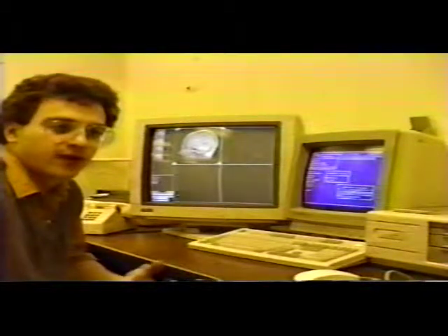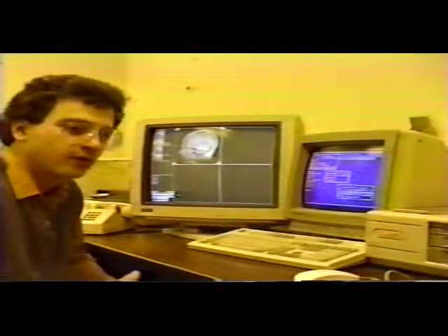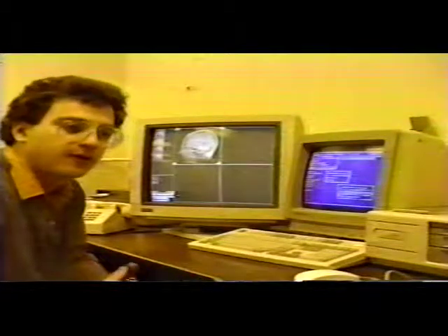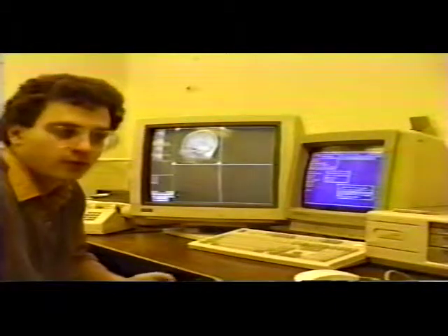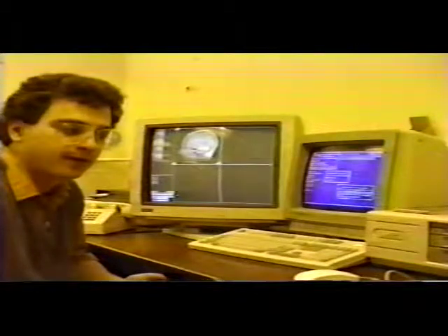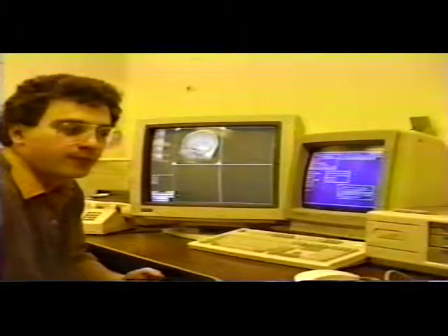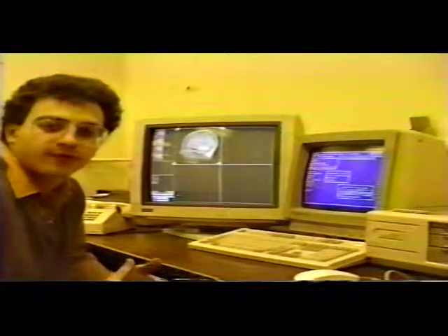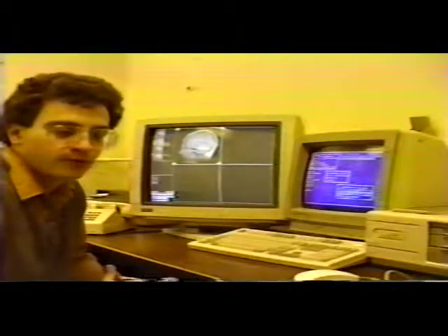It also has the advantage that it stores all information on the disk redundantly, usually on opposite sides of the disk. This means that if the disk is damaged with a pinhole or a scratch, you can usually get back the data. Now, the file system is also redundant in operation. Things fail, it retries, both on reads and writes.